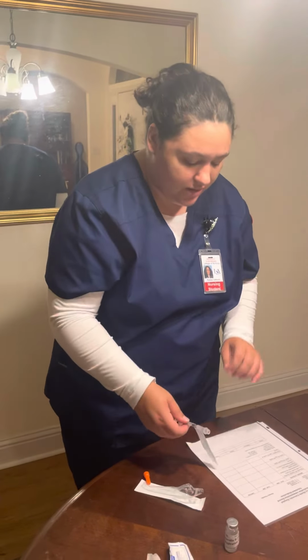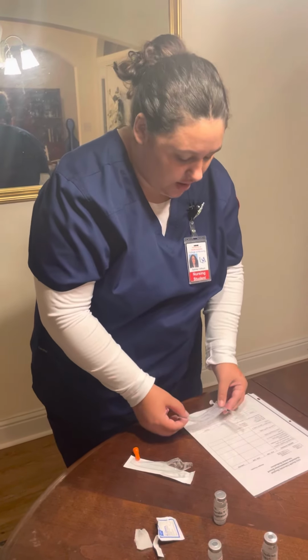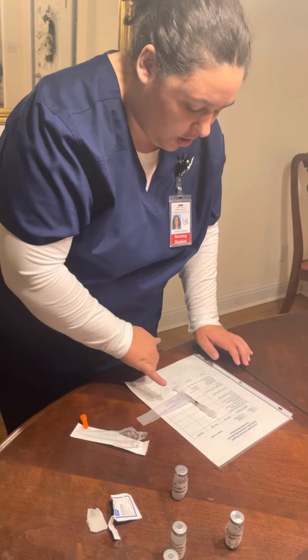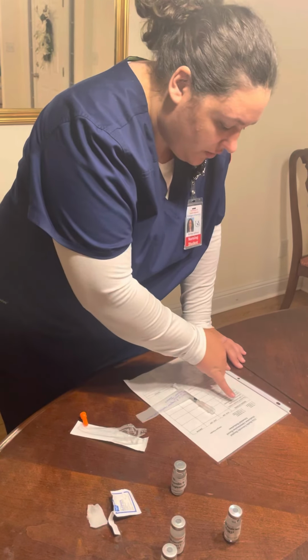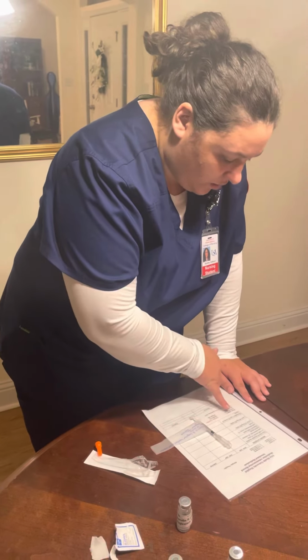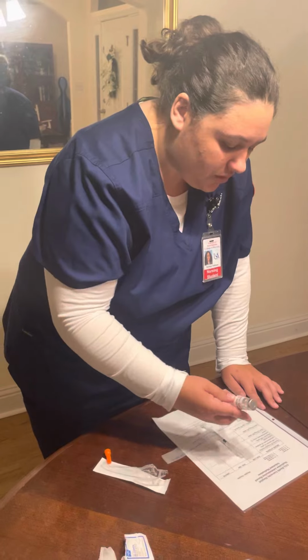And then I'm going to make my tag label for my insulin, which is going to have the drug, the dose, and the name of my patient. And now I'm going to do that to the MAR. Novolin R regular insulin, U100 insulin. 10 units, Jaguar Jones, subcutaneously 30 minutes before meals for control of diabetes.